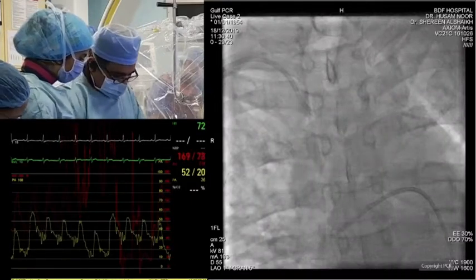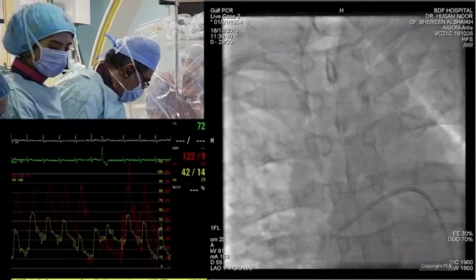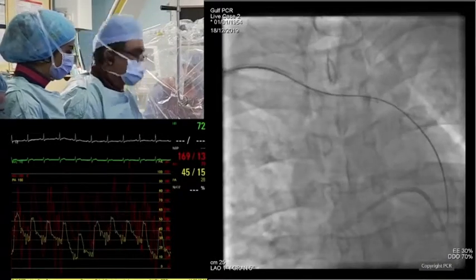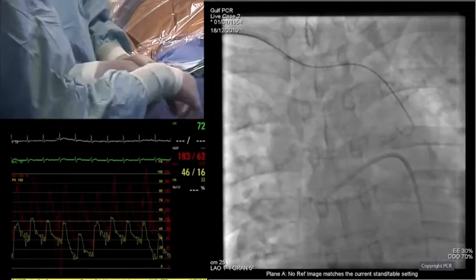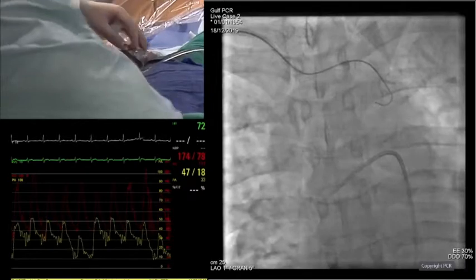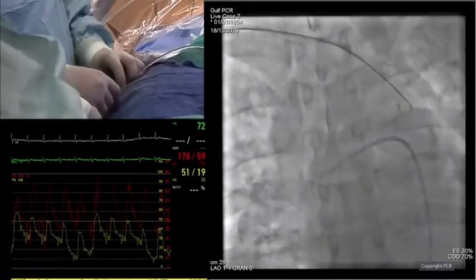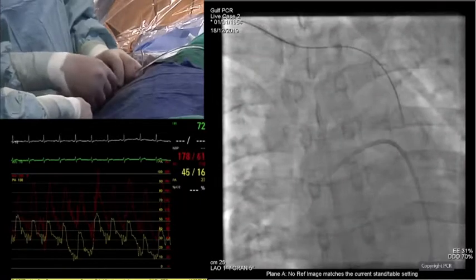Dr. Mohammed Subhi, would you do OCT in this case, or would you just put in a stent and forget about imaging? I think let's go through the case from the first. It's 25% ejection fraction, akinetic inferior wall. We don't have viability, and the FFR of the right coronary is astonishingly 0.8. So for this case, I would do an Impella, and then I would start with the CX and improve it, because the LAD diagonal is very crucial.